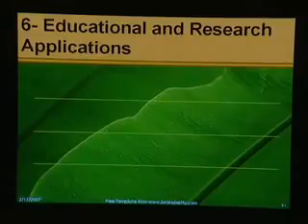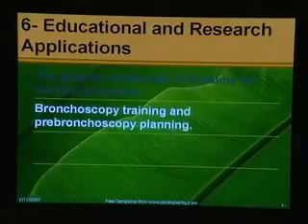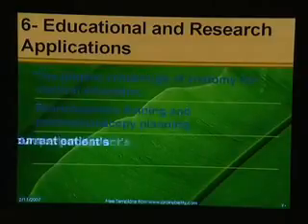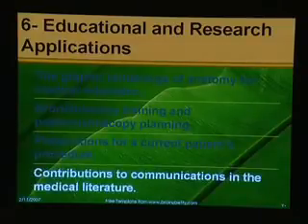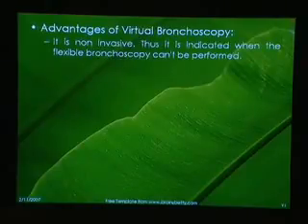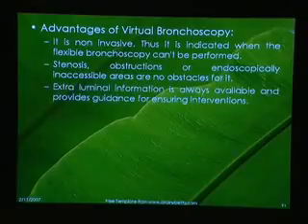Okay. Also, virtual bronchoscopy can be applied for educational and research applications: graphic rendering of anatomy, bronchoscopic training and pre-bronchoscopy planning, preparation for current patient procedures, and contribution to medical literature. Advantages of virtual bronchoscopy include it being non-invasive; stenosis, obstruction and endoscopically inaccessible areas are no obstacle to it.